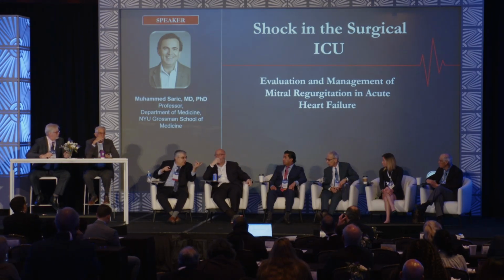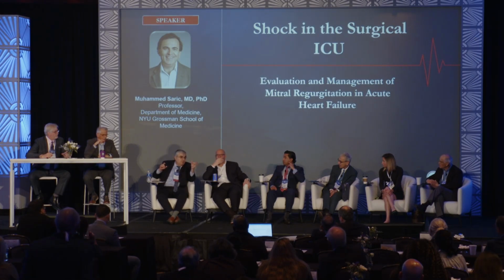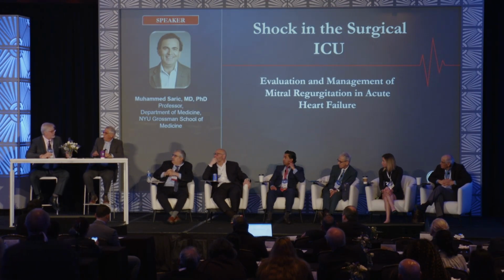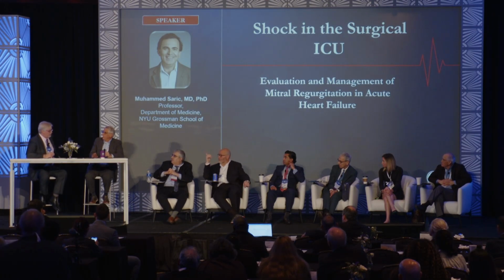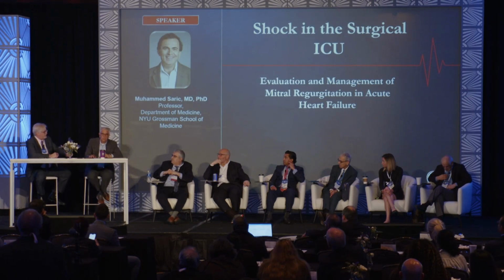What are your thoughts? I respectfully disagree with that really quick if I can. For the VSD, I think it's important to be able to support patients for longer than a couple of days or a week, because you want that septum to disappear and all the edema to go away. It becomes a really easy operation 4 weeks later, and I don't think you can support somebody safely with LAVA for 4 weeks. We had quite a bit of experience with the TandemHeart actually for both, but of course it's difficult to put it in, much more difficult than Impella.